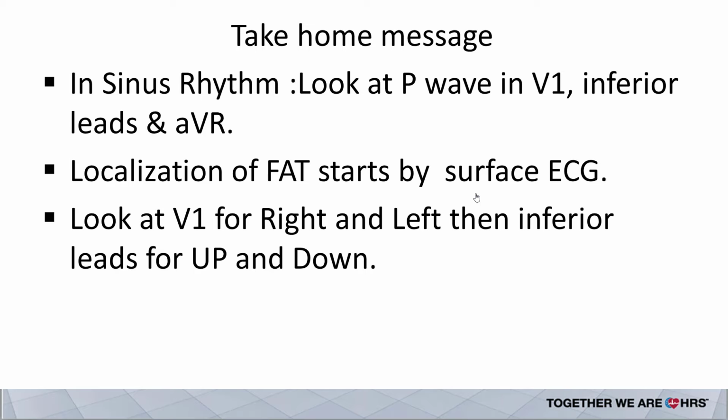Of course, we go by EP, by measurements, by 3D, and then we ablate, and we follow up, and this will end, of course, in success.